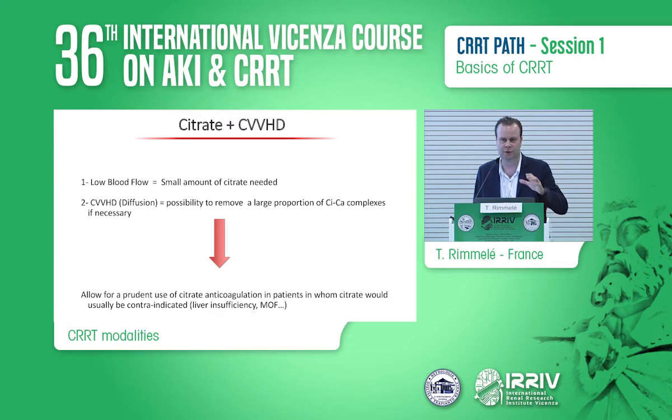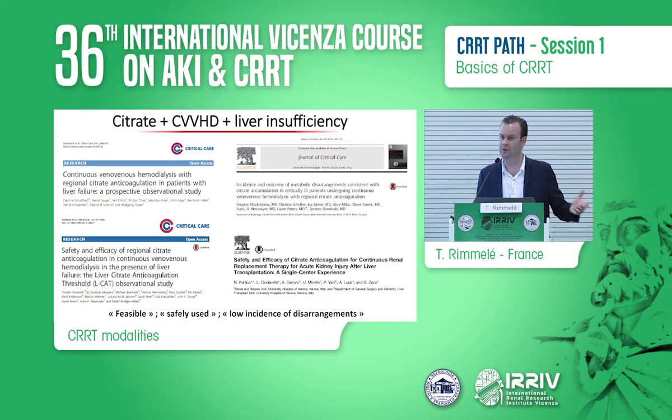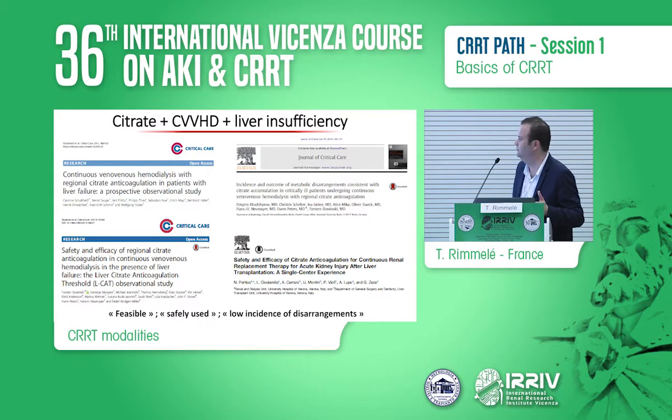But of course, you can't do this if you're a beginner with citrate. If you know enough about citrate, you may be able to push your limits by being prudent with this protocol. And if you look at the literature, this is confirmed. A lot of papers have reported a safe use of citrate with CVVHD and liver insufficiency: feasible, safely used, low incidence of derangements.